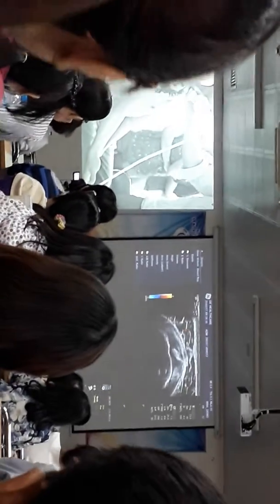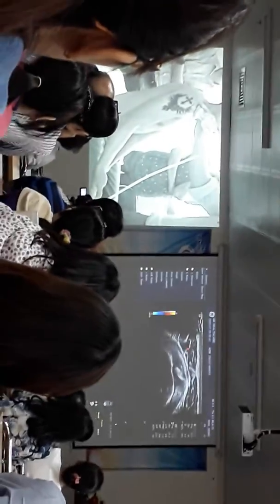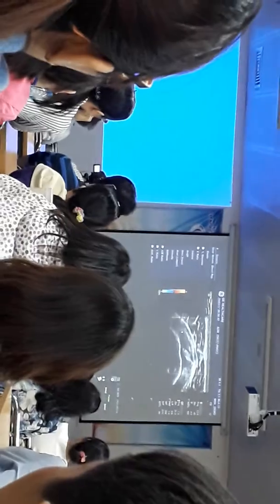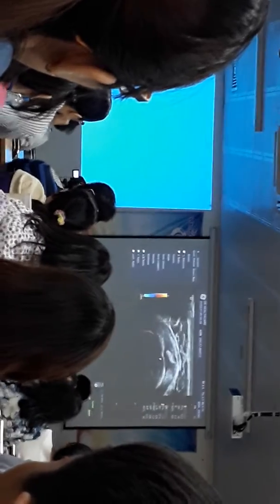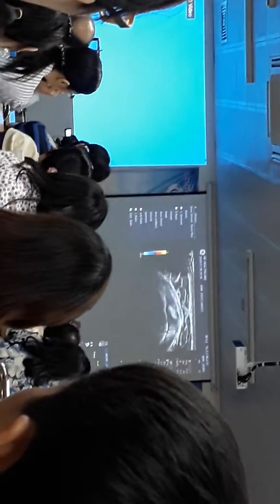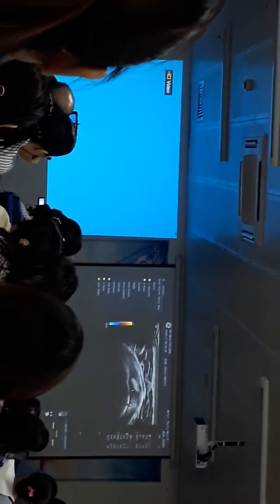Sử dụng cái chế độ color để kiểm tra cái đầu dài cơ nhị đầu. So this here is subscapularis. This is supraspinatus. Ở đây phía trước là cơ dưới vai, ở phía sau đây là trên gai. This is long head of biceps. And đây là đầu dài cơ nhị đầu cánh tay.